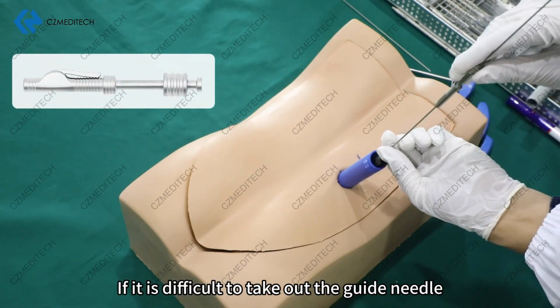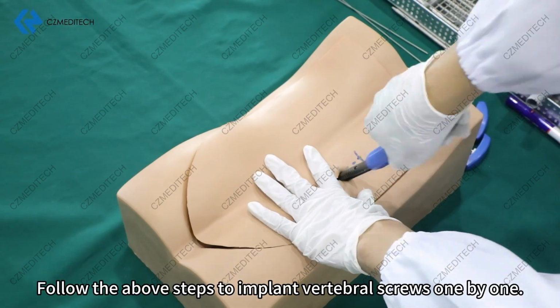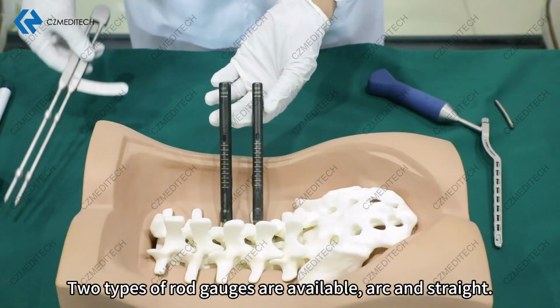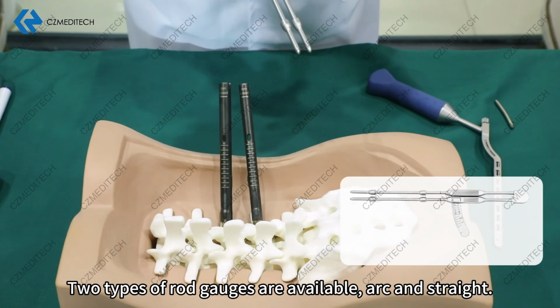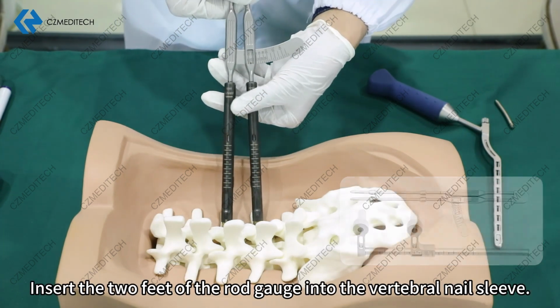If it is difficult to take out the guide needle, the extractor can be used. Follow the above steps to implant vertebral screws one by one. Two types of rod gauges are available, arc and straight. Insert the 2 feet of the rod gauge into the vertebral nail sleeve.